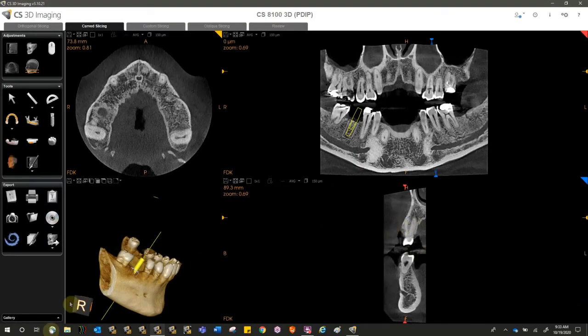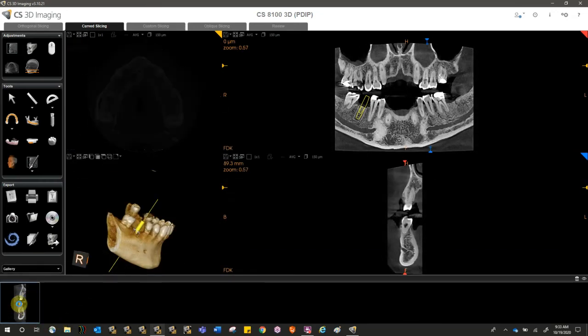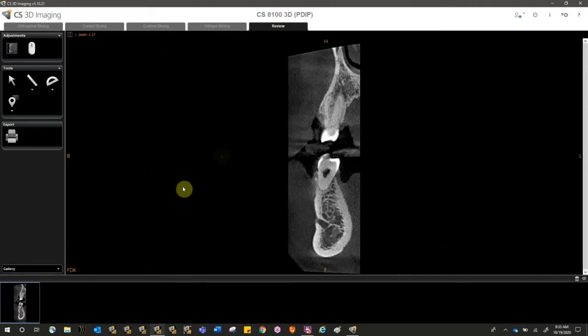Over on the left-hand side, we get a couple of adjustment areas. Okay, we can change our MPR adjustments as far as the brightness and contrast. And then we have our mouse controls here. Up in the tools area, again, we have our selection mode. We have our tool to create any measurements. We can create multiple measurements, one if we wanted to. If you wanted to do any angles, you can do angles, and then you can pin it if you want to.